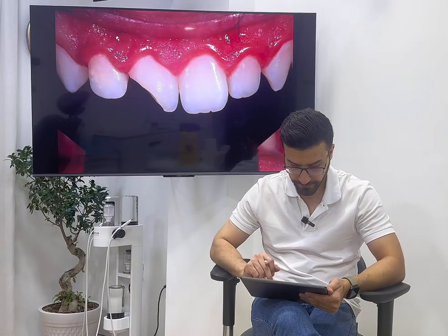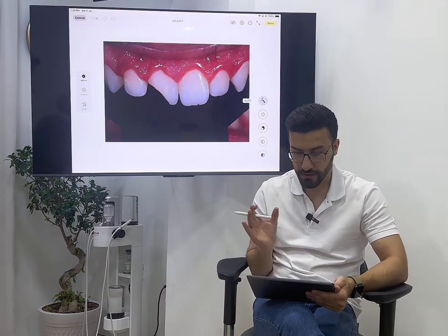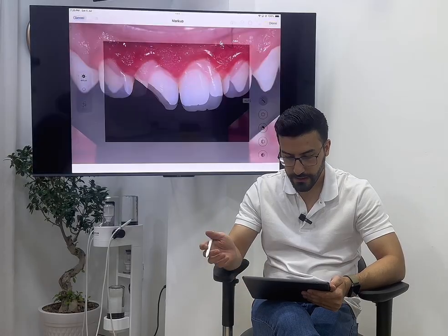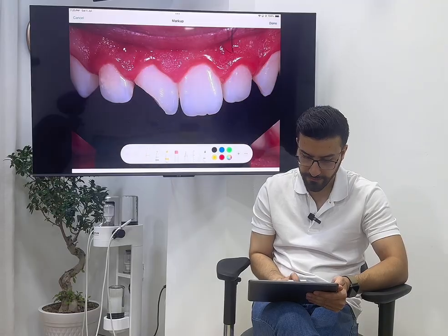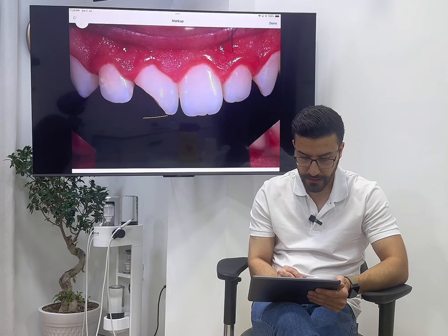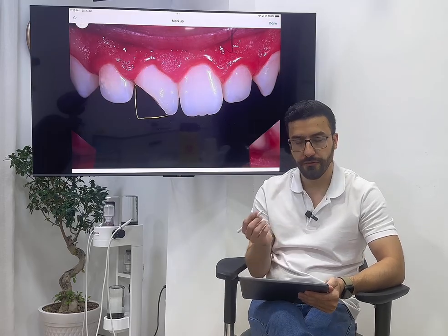Okay, so let's talk about this class 4. First of all, before starting, I have to know several factors. For example, here, what do I have? I have a large class 4.